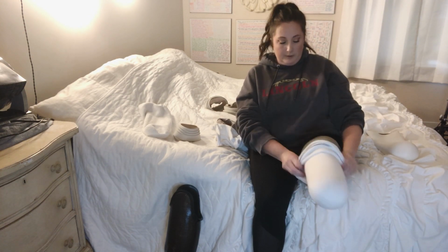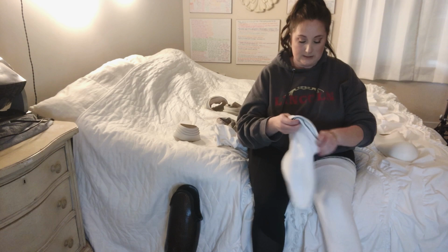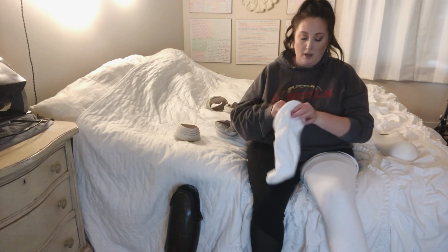This is 5. This is 3, so this makes 8. And this is a 1-ply, and I have more in the drawer. I can put more on. They're just not going to fit in the socket.